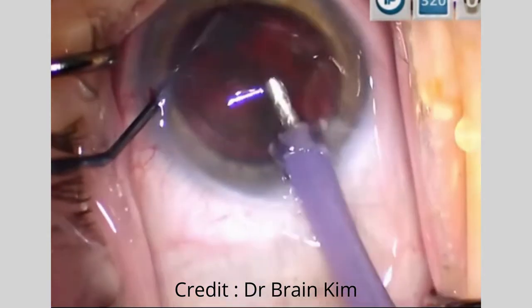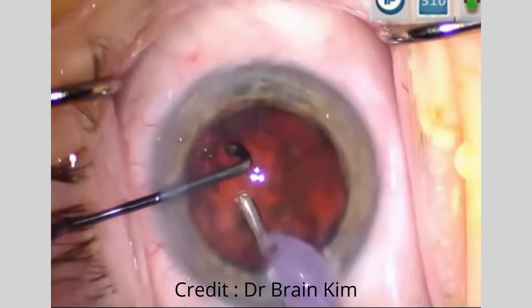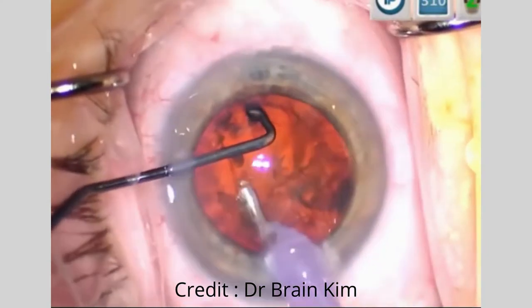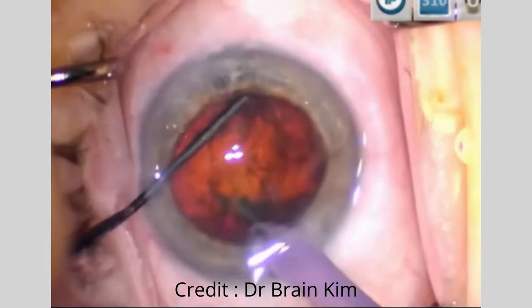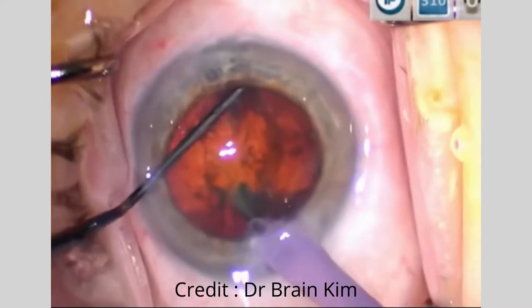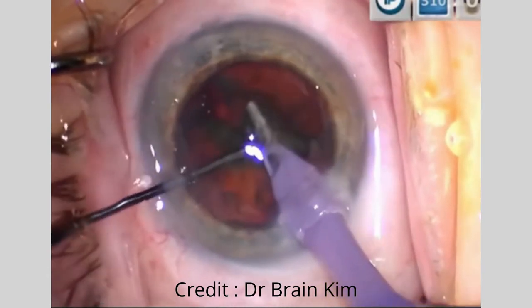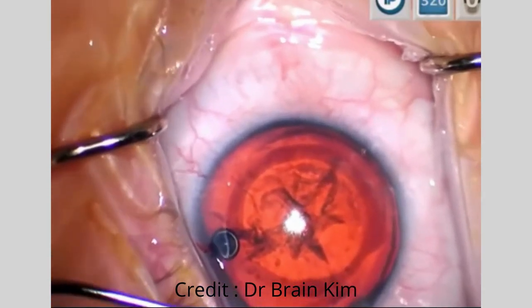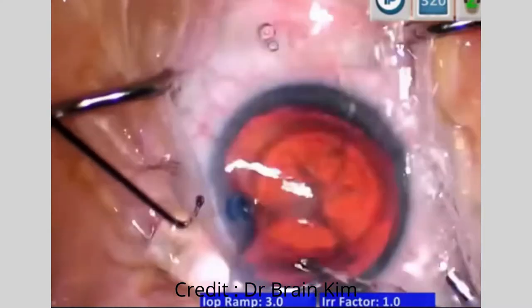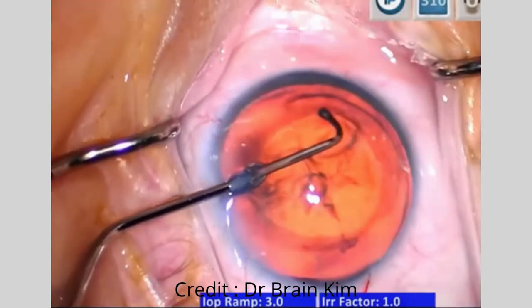I pronated my hand, went out underneath the anterior capsule to the equator, and then supinated. After I clean up the epinuclear material with the phaco — pronated, slide it past the anterior capsule, supinated — the chopper tip is again within the anterior capsule opening, bevel down into the epinuclear material but outside of the endonucleus, gliding the two pieces together, fracturing the endonucleus within the same horizontal plane. I am always beveled down with my phaco tip, and there's an angle to this balanced tip that allows me to hold the endonucleus.